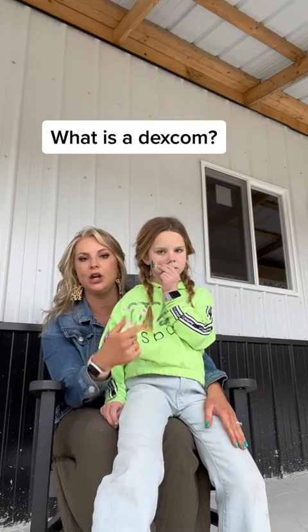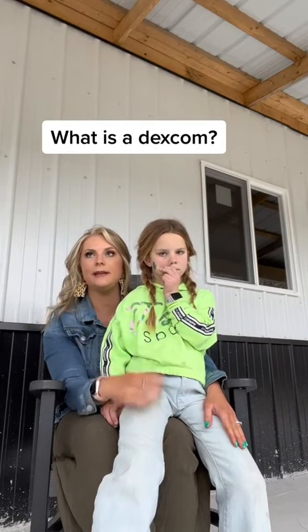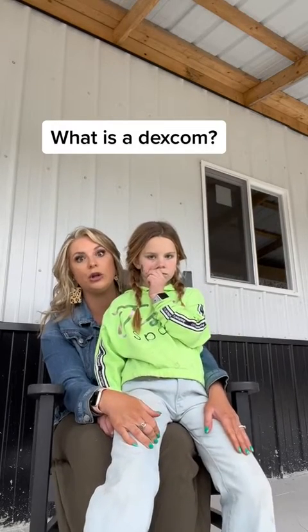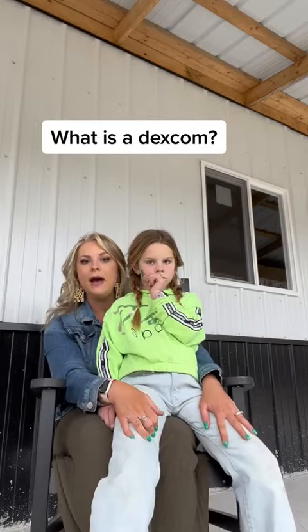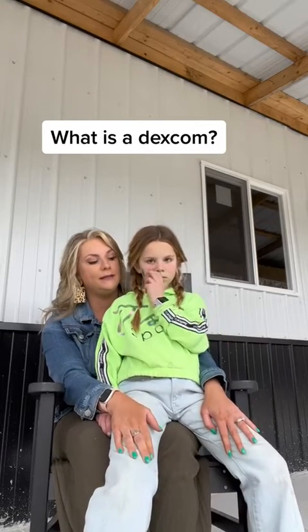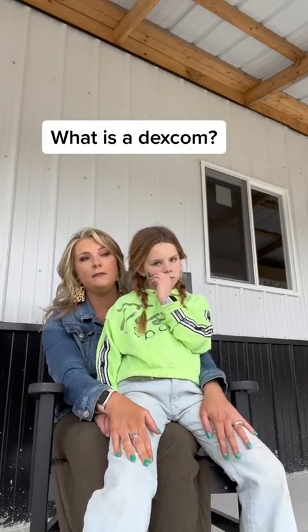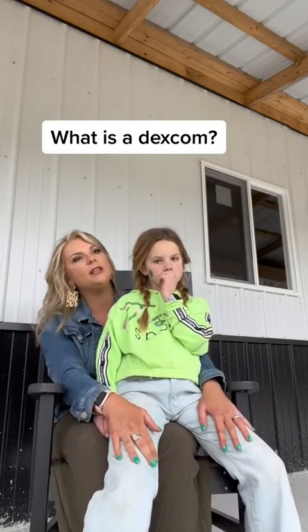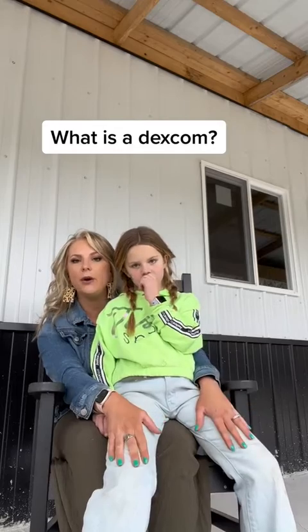It reads her blood sugar every five minutes, and sends it to her phone and then to me and my husband's phone, so we can see if she's high or low. If she's going low, it'll alert us in the middle of the night. It's basically a life-saving tool. We change it every 10 days, and she gets cute little patches that go over it — she gets to accessorize.